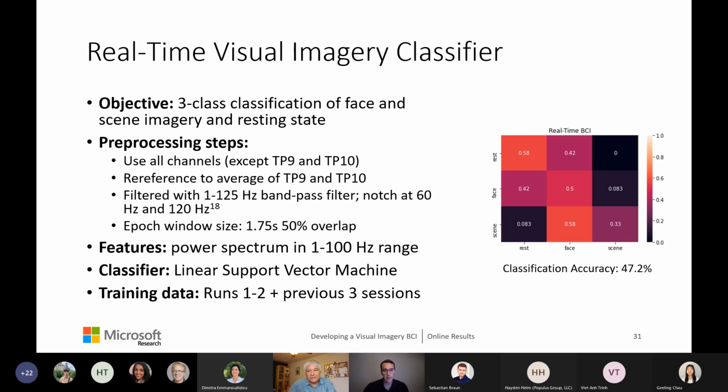This is how we did the data collection for one of our studies. But those are members of the BCI team with certain skills and ability to work with the equipment. Unless the equipment is enormously simple to use, that could be a problem.